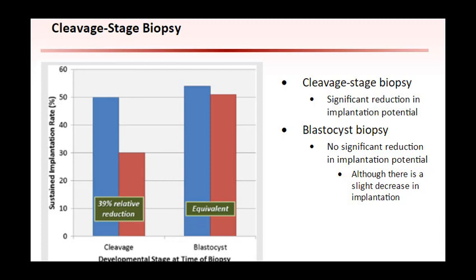While the study suggests that cleavage-stage biopsy can harm embryos and blastocyst biopsy does not, one must be careful to remember that with cleavage-stage biopsy, every embryo could potentially be biopsied. With blastocyst biopsy, typically only those embryos that have shown sufficient progression are biopsied and all others are discarded. Therefore, only the best of the best are biopsied.